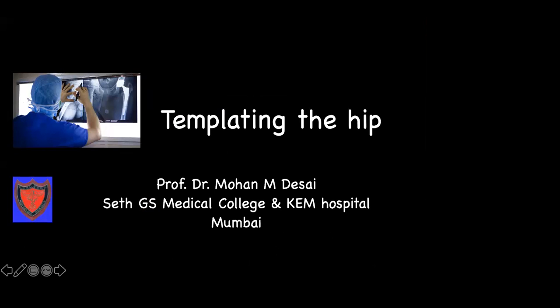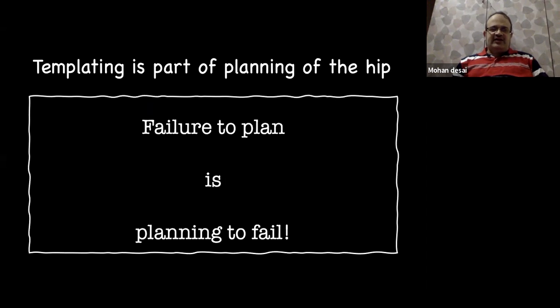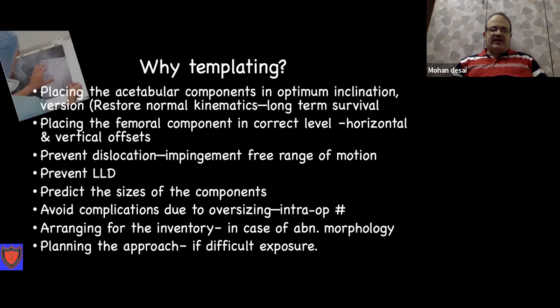Yeah, okay. So today we'll talk about templating of the hip, but templating is a part of the planning of the hip, and I will also be talking about something more than templating, about planning as well. We know that failure to plan is planning to fail, and why do we require templating?